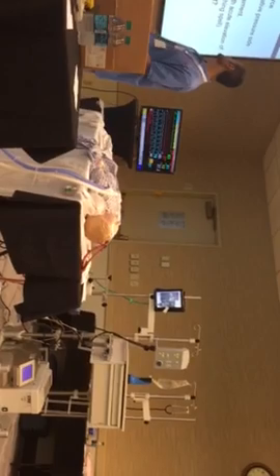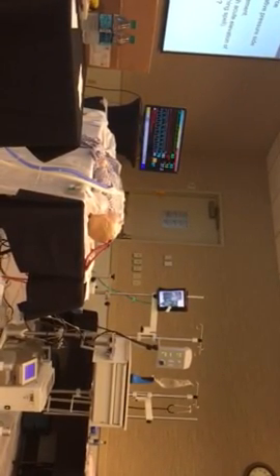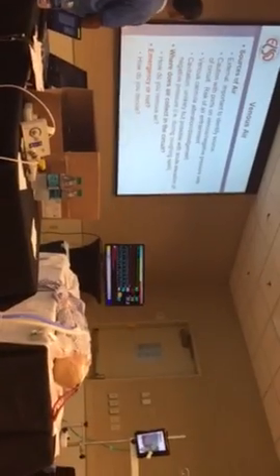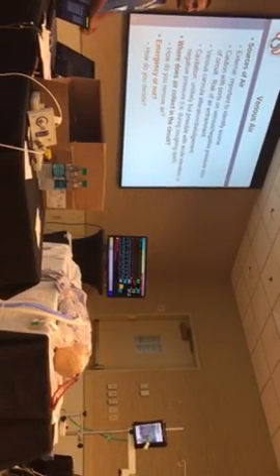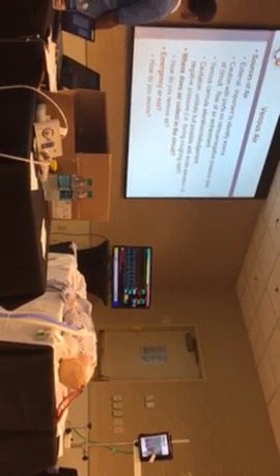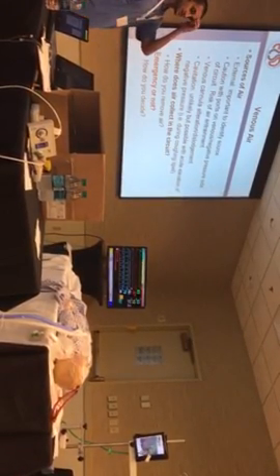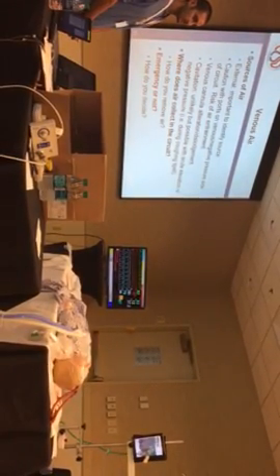So in terms of management, and in terms of sources of air, I think we covered all these. So external, that's entrainment, cavitation is within, and of course the venous cannula. So manipulation of the venous cannula, this patient was coughing a lot, of course, which was a problem. And then in terms of deciding on an emergency, that was the question about is it pre or post oxygenator, and are you on VV versus VA ECMO.